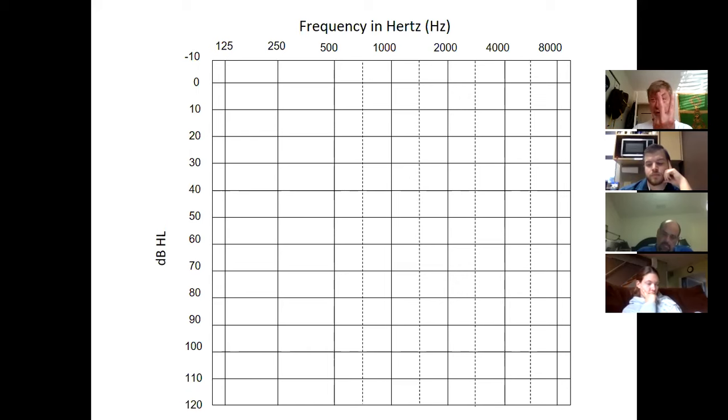Okay? So those two things about the audiogram. Number one is the degree of hearing loss. And number two is the type of hearing loss. Is it conductive? That means air conduction was bad and bone conduction was normal. That's conductive. They're blocking the conduction of sound, like electricity is conducted through a wire. If something's blocking the passage of sound, it's usually outer ear, like wax, or middle ear infection, conductive. If it's sensory neural, the hearing is bad by air conduction and it's equally bad by bone conduction. Air conduction thresholds equal bone conduction thresholds. You've got sensory neural loss, both ears.